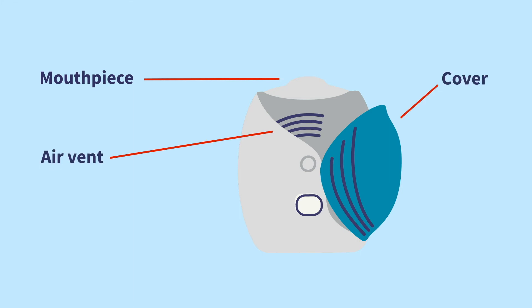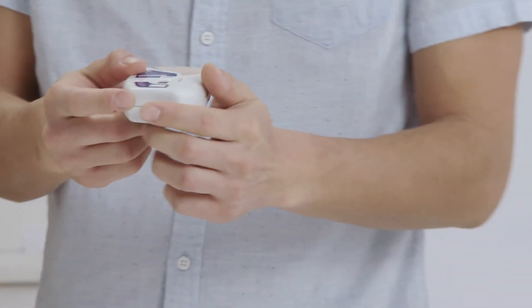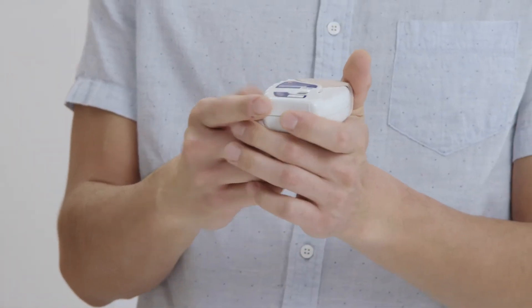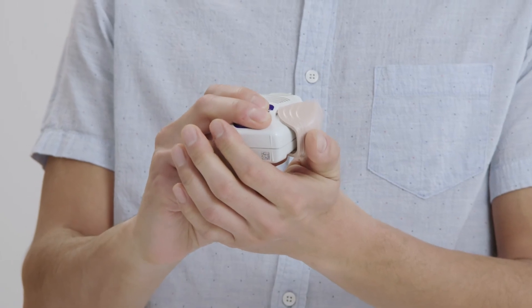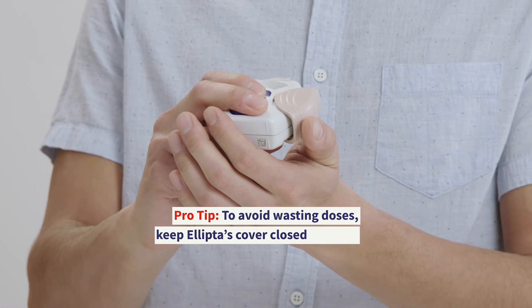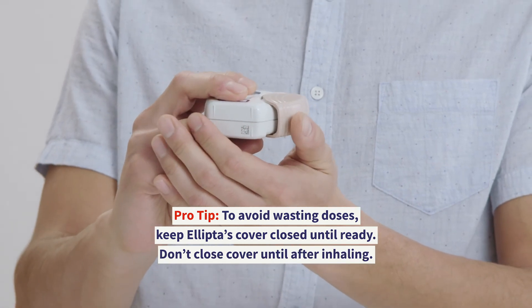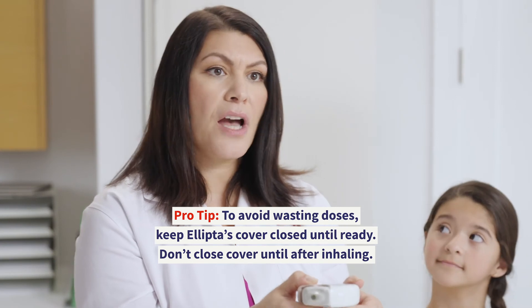Now for the Ellipta DPI. To use the Ellipta, first slide the cover down until you hear a click. The counter will count down by one, showing you that your Ellipta is now ready to use. To avoid wasting doses, keep the Ellipta cover closed until you're ready to use it, and don't close the cover until you have inhaled all the medicine.